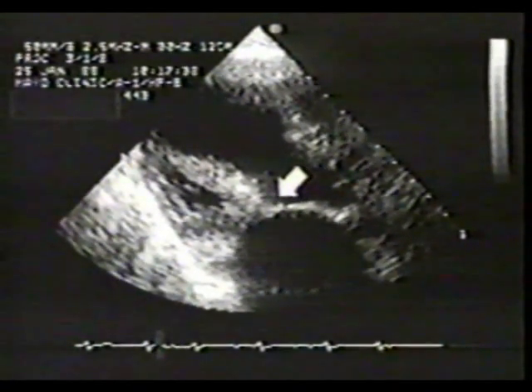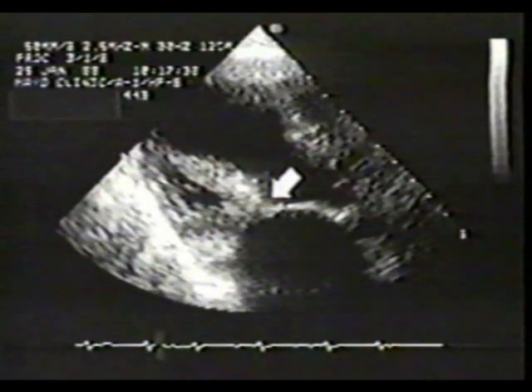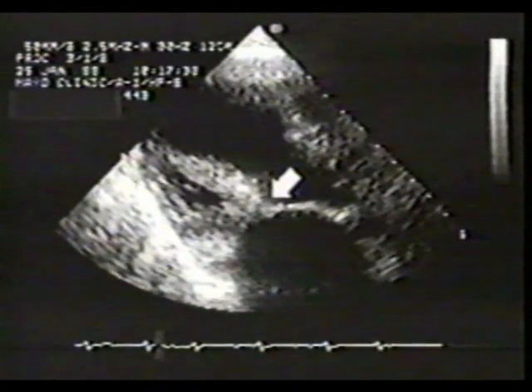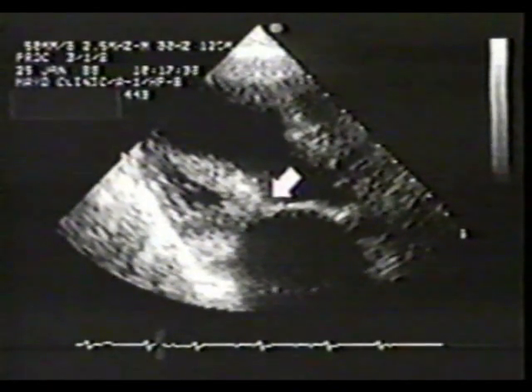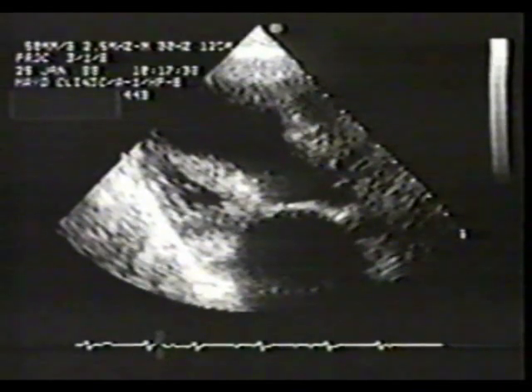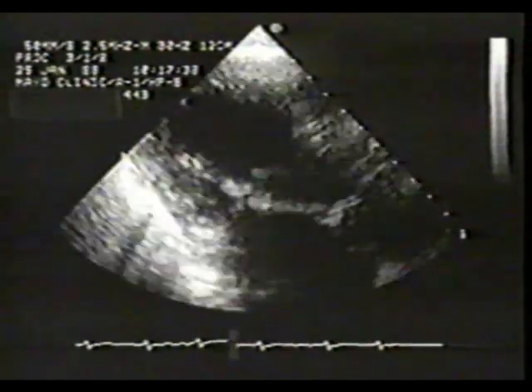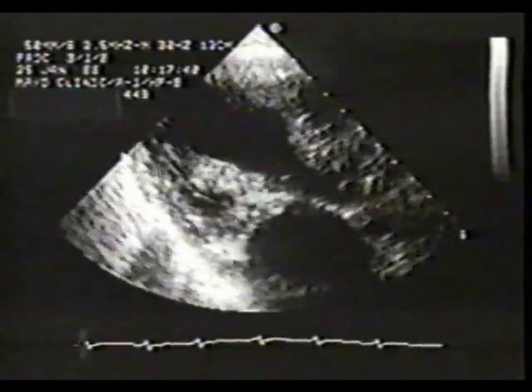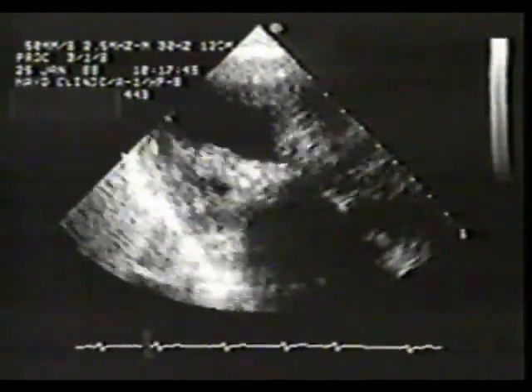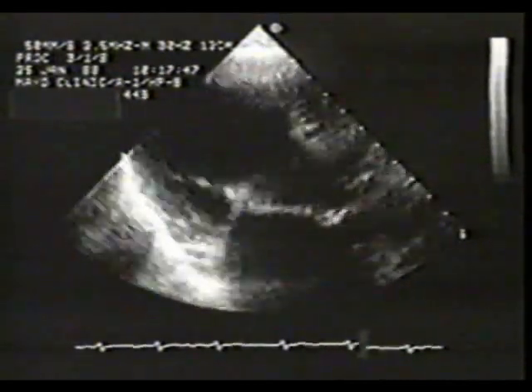Note the marked chordal shortening and thickening. In cases such as this, the true minimum orifice is subvalvular and cannot be identified for planimetry. In real time, the transducer will be tilted from the subvalvular apparatus up to the tips of the leaflets. Patients with such severe subvalvular involvement are not suitable candidates for balloon valvuloplasty.